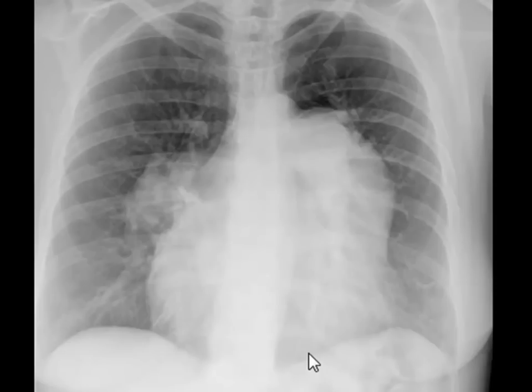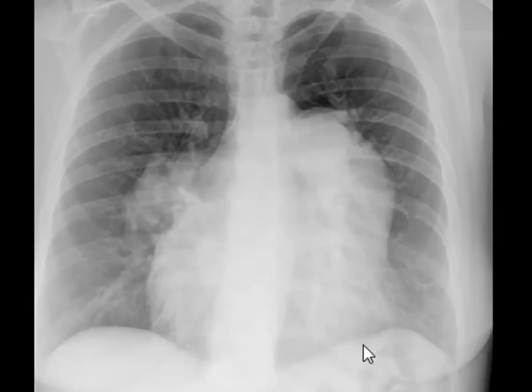Hello everybody, once again another chest X-ray. We have seen this X-ray before in our last video, where we used it to discuss a condition known as pulmonary arterial hypertension.